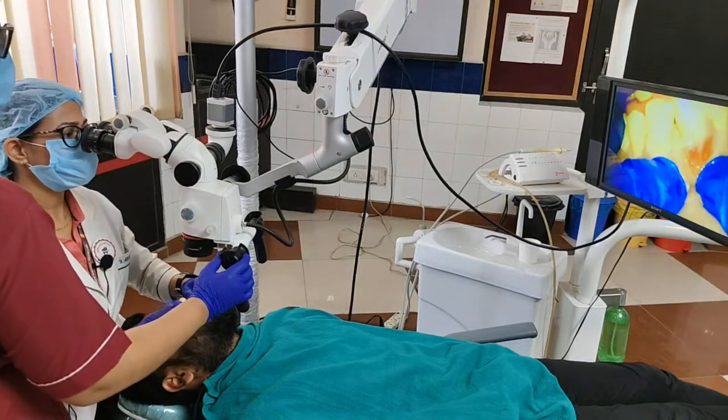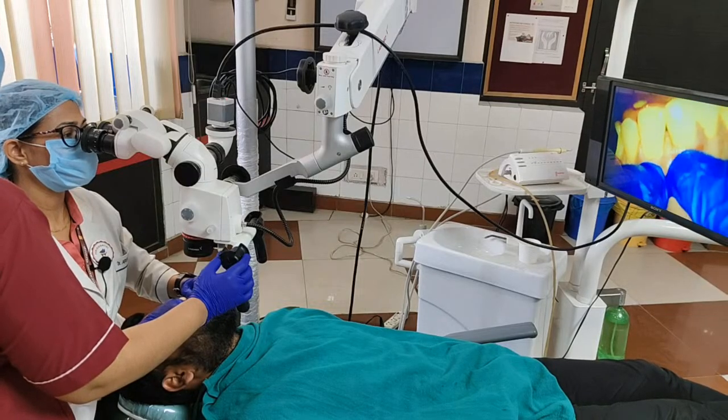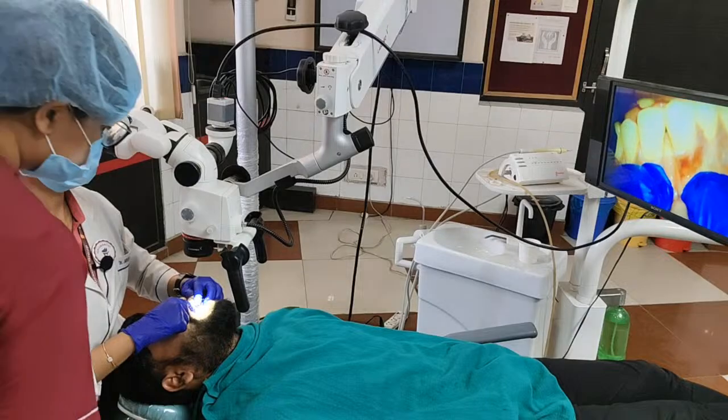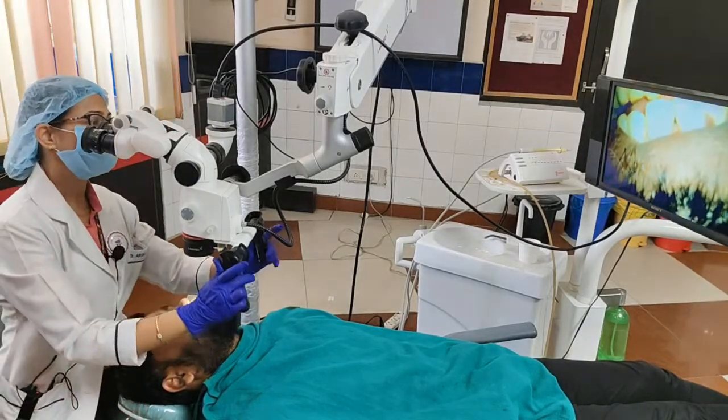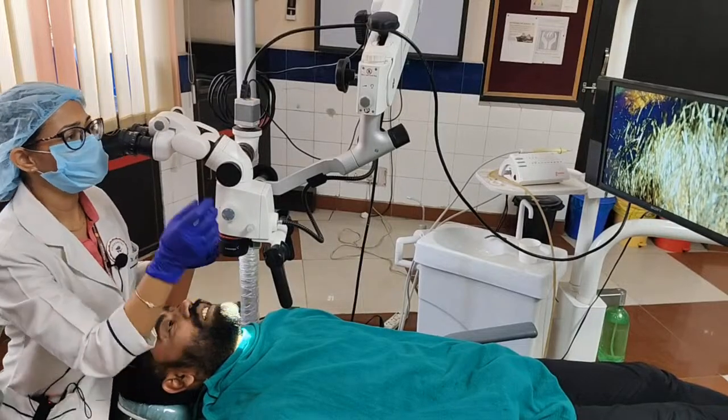Can you see here? That is the connective tissue because it is not reflecting the light. Can you see that scraped away epithelium here? Yes, ma'am. So that's how you know that you are safely there. Okay. So we are going to speak to the patient.